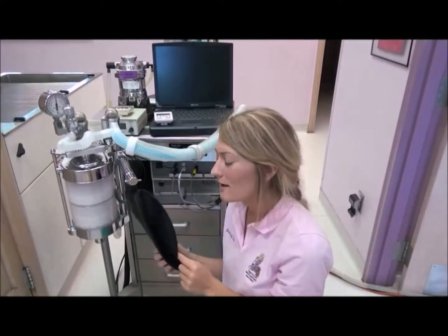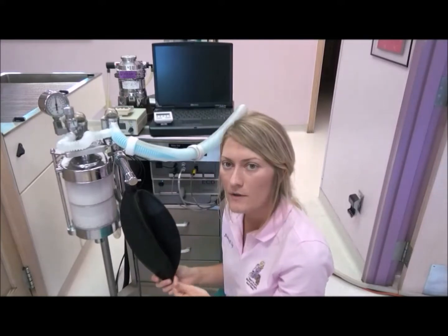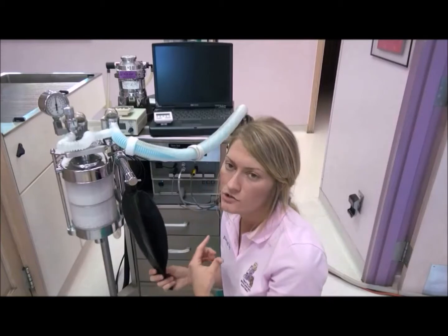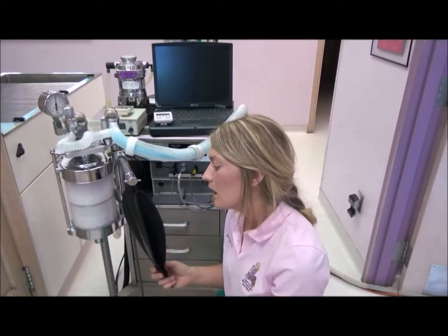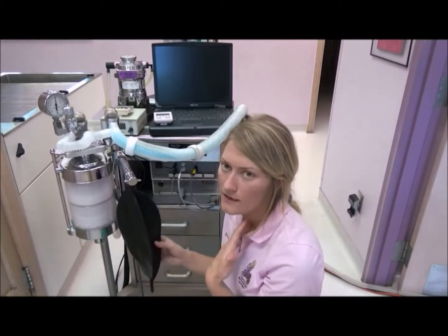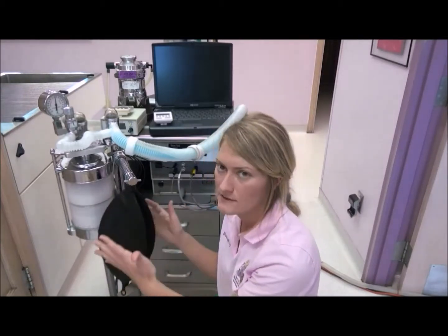This is a breathing bag. And first off, you want to make sure that you pick an appropriately sized one for your patient. But this allows you to observe the animal's breathing. It also serves as a reservoir. And also, in case you need to manually ventilate for the patient, this allows you to do that.